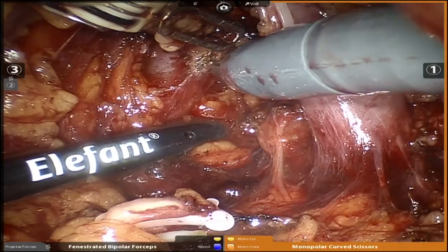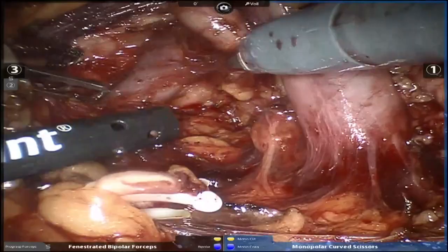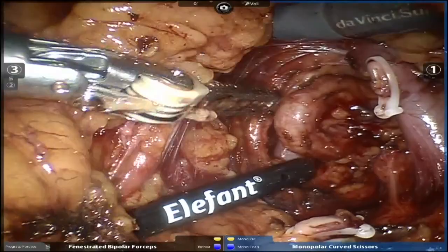It looks like the splenic, actually. Why is it so low? This could be the splenic vein here too, but it seems, well, the IMV at this point possibly, but all right, we'll leave it alone. But the other thing to do is just to go this side. There's ureter, there's kidney.